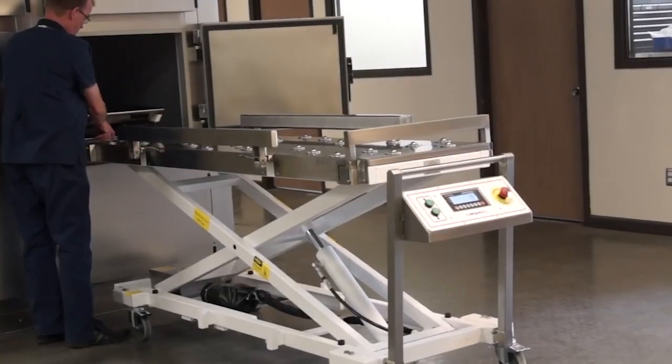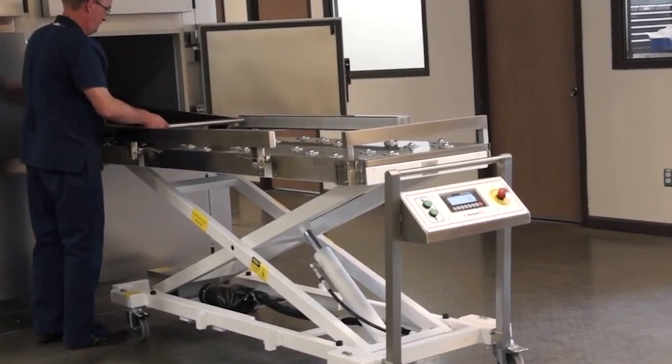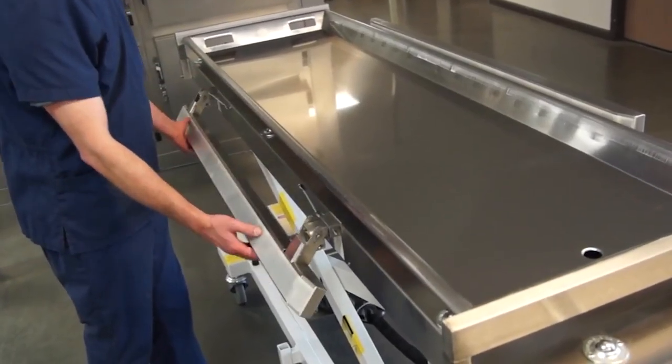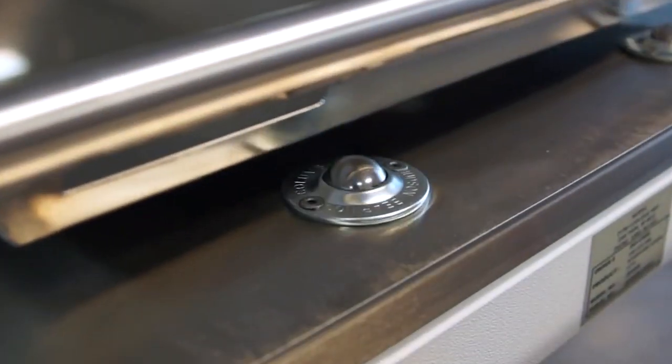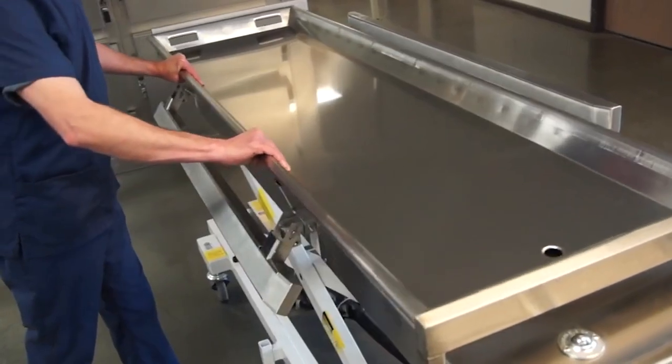Red Wing lifts are equipped with end access for loading and unloading body trays. The JD 5000 lift has both end and side loading access. Using rollerball technology, body trays can move across the lift surface in any direction needed.